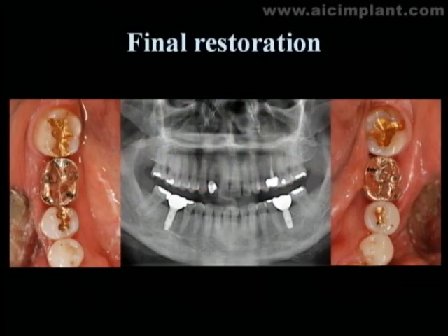In this case, the treatment for the mandibular left area was completed using a GS2 implant as well as a cement-retained type prosthesis using a rigid abutment. On the other hand, treatment for the mandibular right area was completed with an SS2 wide platform implant and a cement-retained crown using an excellent solid abutment.